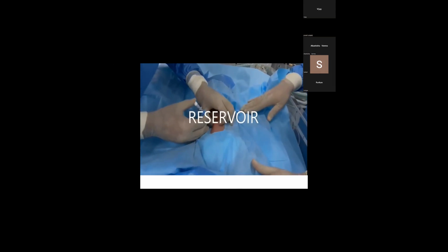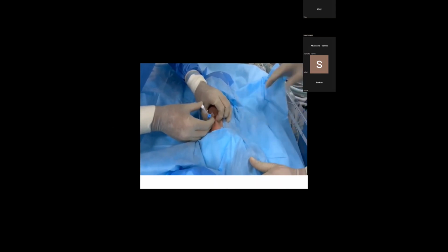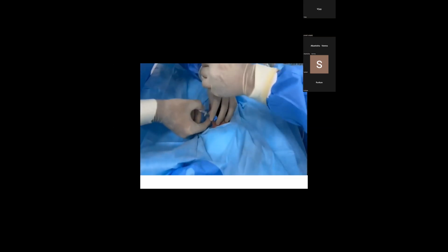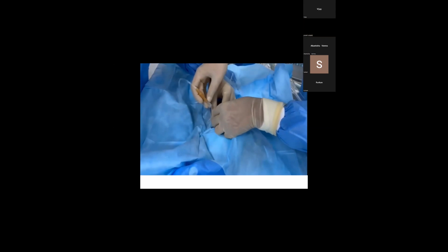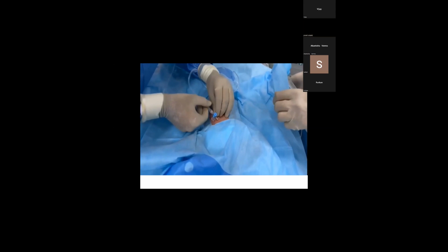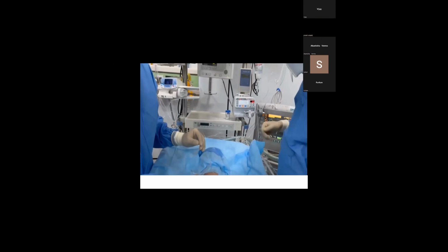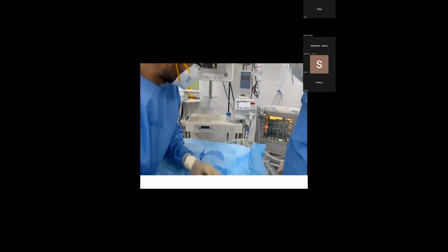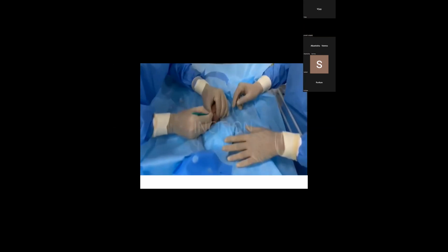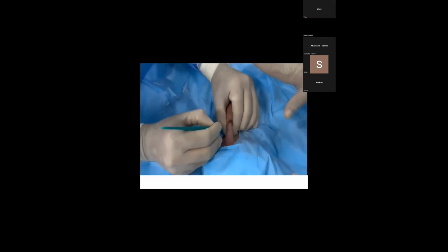Next, we have to create a reservoir in the peritoneal cavity, because if we directly puncture the abdomen with the PD catheter, it may cause trauma to the bowel. So first we create a reservoir using a 22 gauge cannula, and then instill 20 ml per kg of warm dialysate into the baby's abdomen, that is, into the peritoneal cavity. With this, the bowel gets displaced, so when we insert the peritoneal dialysis catheter, it will not cause trauma to the bowel.